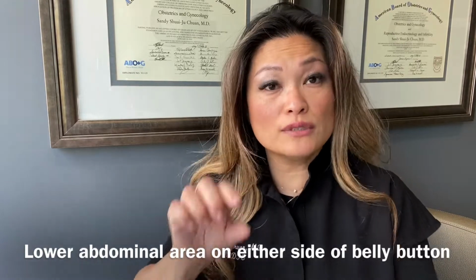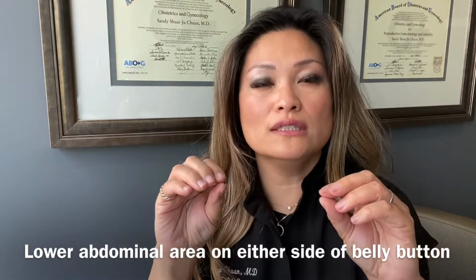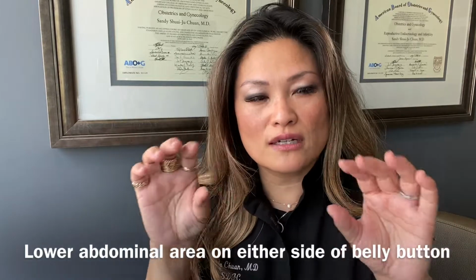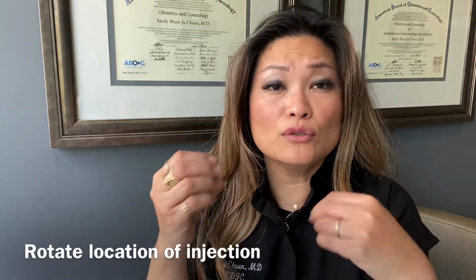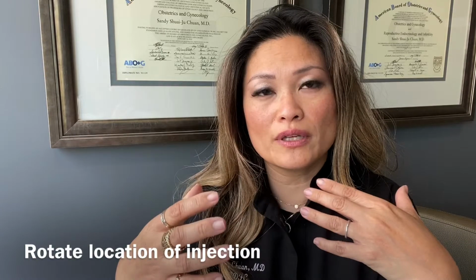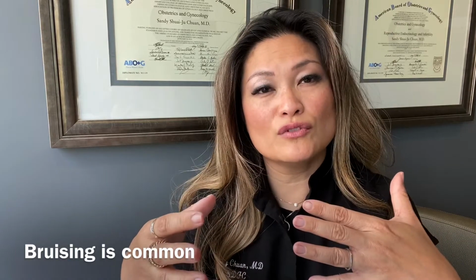You want to rotate, because there's a strip of skin and flesh there that you can inject in. It doesn't matter if it's a little bit to the left or a little bit to the right, just go in that general area. You will notice that some injections might cause bruising, so it's good to rotate the area so you're not going into a bruised area. Not that it's going to hurt anything, but it might feel a little more uncomfortable.